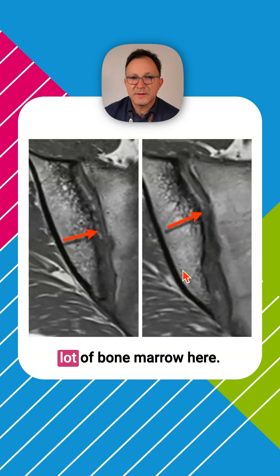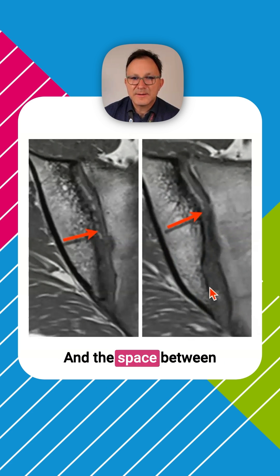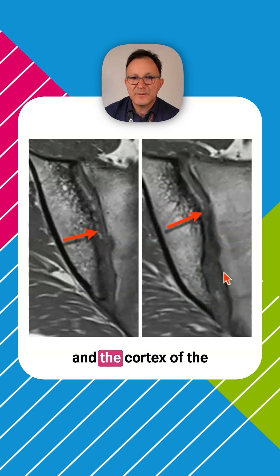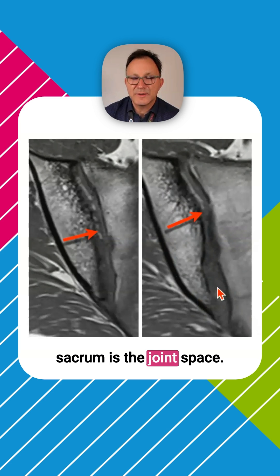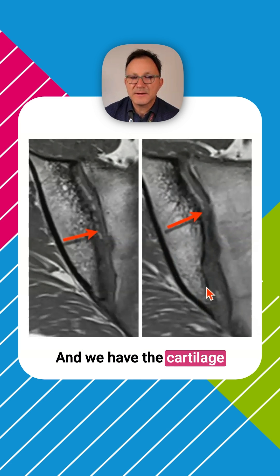So you see some of the trabeculae here and a lot of bone marrow edema here. And the space between the cortex of the ilium and the cortex of the sacrum is the joint space. And we have the cartilage in between here.